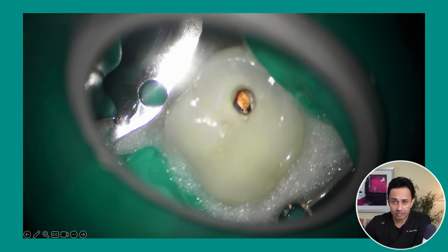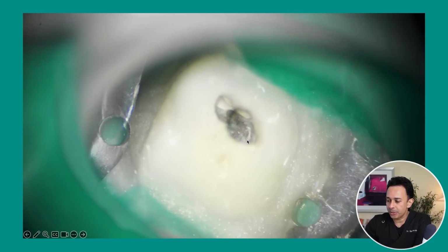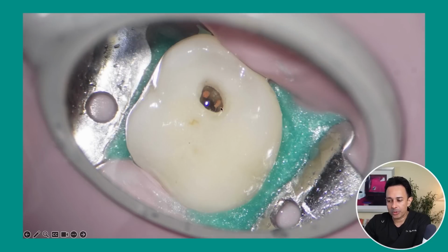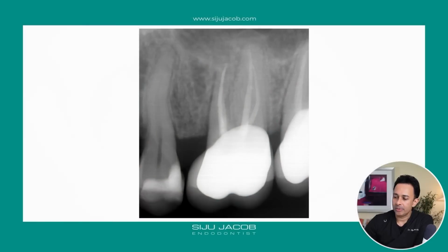That's the MB1, the filled MB1. And of course, towards the mesial surface of the filled MB1, we looked for the MB2, located the MB2, and then you can see the small access and the MB1 and the MB2, enabling us to preserve the existing crown. And then we obturated the MB1 and MB2 alone, and sealed the access with a composite resin to preserve the crown. So that's how the post-op looked. This is something that almost every dentist sees in routine clinical practice.